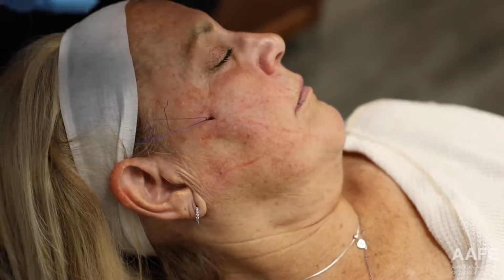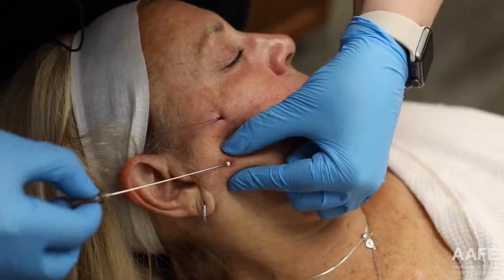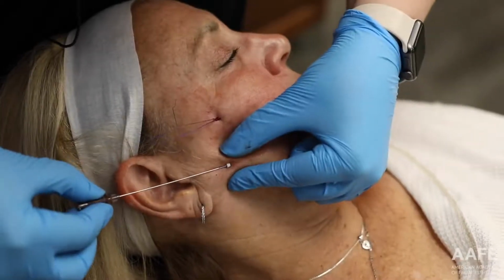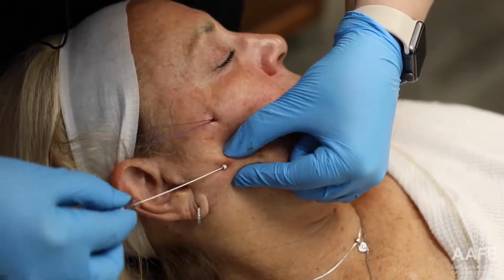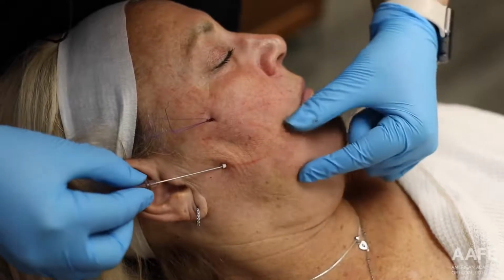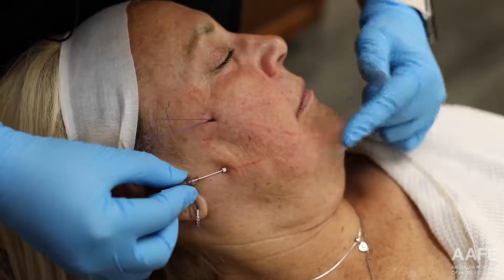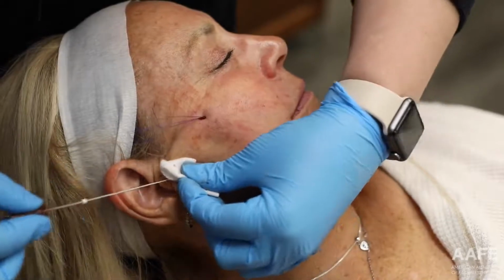Okay, using the same kind of thread, just gonna slip in, and I'm following this jawline all the way kind of towards this marionette line. So again, just watching my depth, always checking and seeing where I'm at. And truly, when you're in the correct plane, you can see how easily it just slides. And the patient is super comfortable as well when you're in the correct plane.